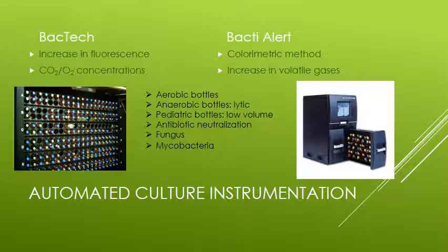Basically, we have a couple of major systems out there, BacTec and BacT/Alert, and I'm not endorsing either one, and there are others I'm sure out there. These are the two most familiar, most used in the micro lab. Generally speaking, the way these work is the machine can sense things like a change in pH or a change in the headspace pressure in the bottle, right? Those are common things that they can use.